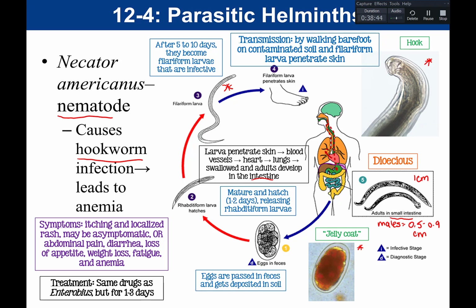In terms of diagnosis, just based on everything we've learned so far, what do you imagine the diagnosis would be? And so, diagnosis, identifying the eggs in a stool sample. So again, taking a stool sample and looking for the presence of the eggs in that stool sample.